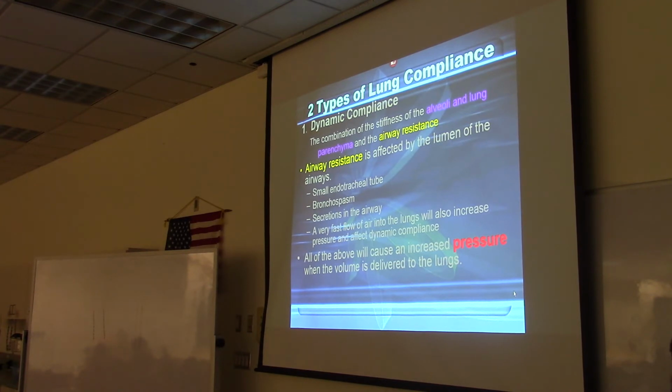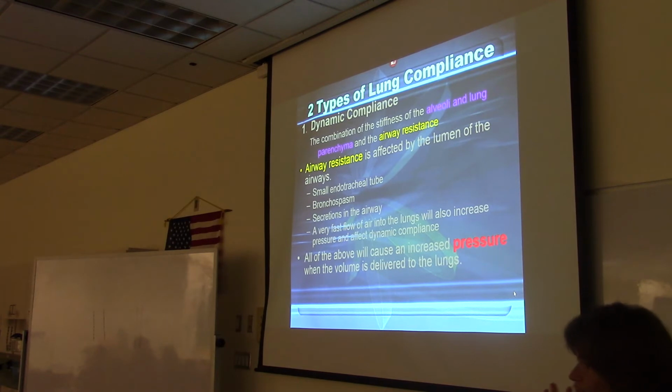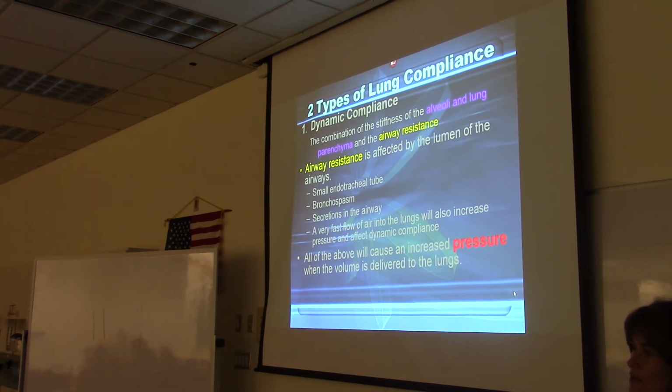So does it follow that if you have secretions plugging up the airways, it's going to take more pressure to push the air in, if you've got all the secretions in the airways and you've got to get the air past all those secretions? It'll take more pressure? Does that kind of go together?